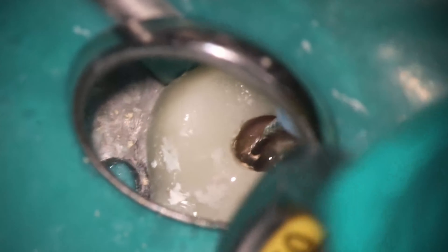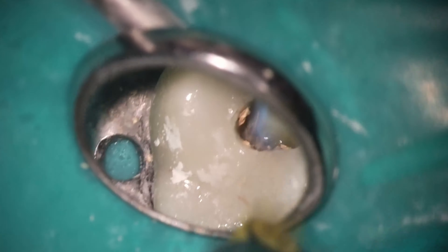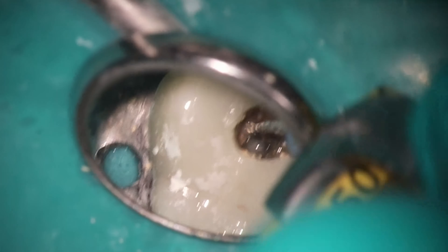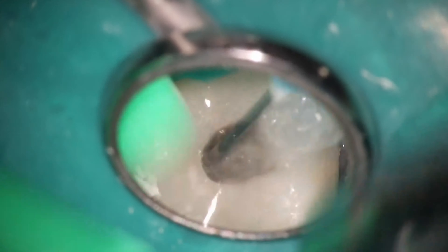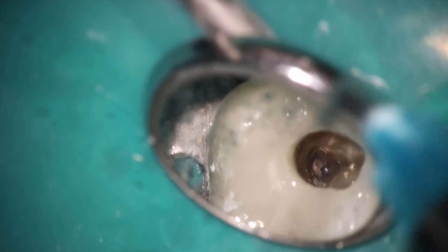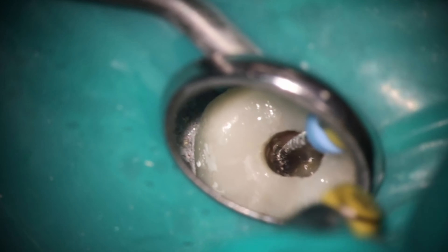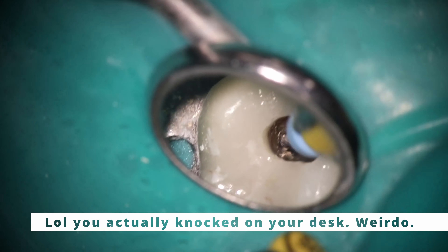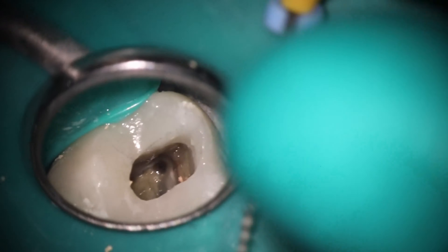Hedstrom files are really useful just to get that stuff off the side — that pulling motion really does work well. I love having these file forceps for this, because it's very easy to do the pulling motion and also see what I'm doing. If I was using my hands, there's no way I'd be able to see inside this access. If you haven't picked up one of these file forceps, I highly recommend it. I think this is Hugh Friedy or G. Hartzell — I've linked it before. We get them from Shine and they last absolutely forever. I have never had one break.